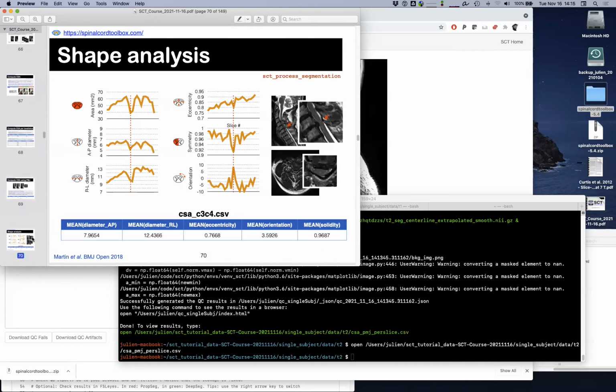Yes, good point. Okay. Other questions for the process segmentation?